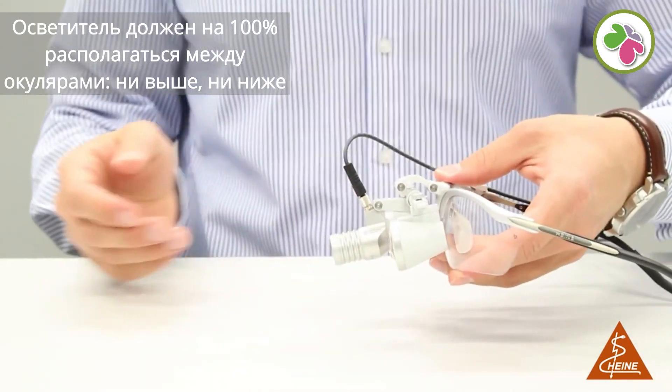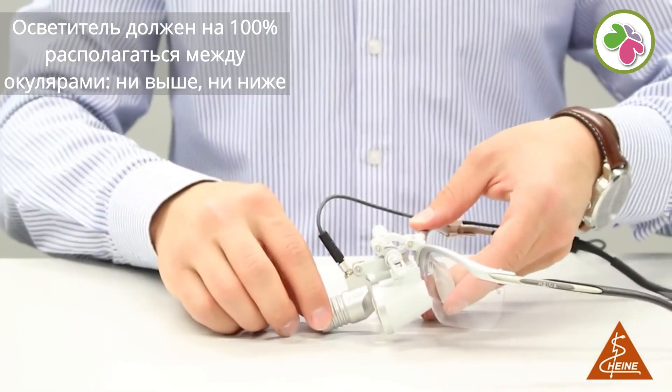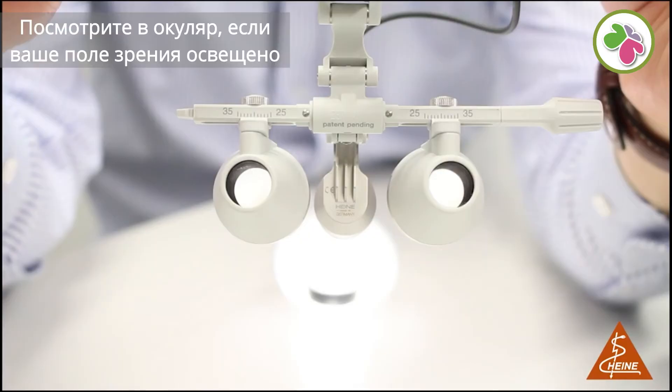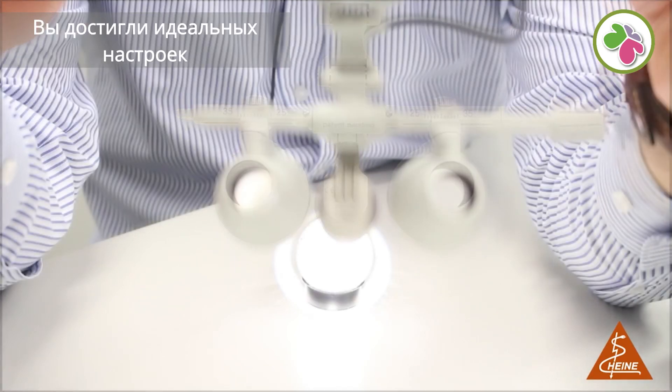The light should be 100% in between the oculars — not above, not below. Look through the oculars. If your field of view is illuminated, you have achieved the perfect settings.